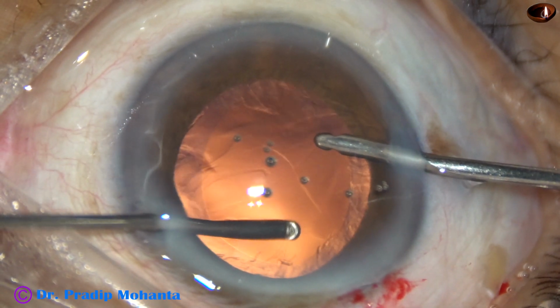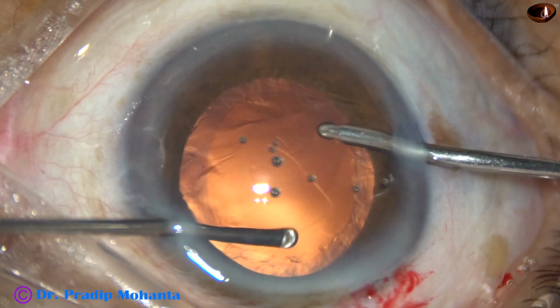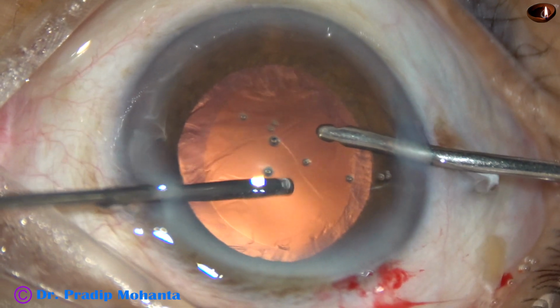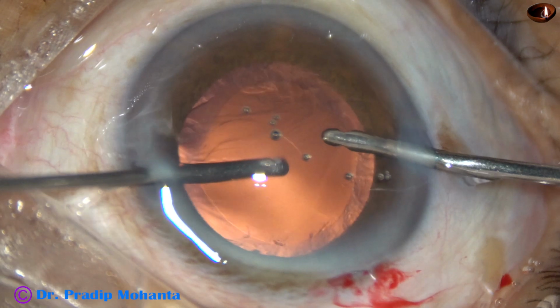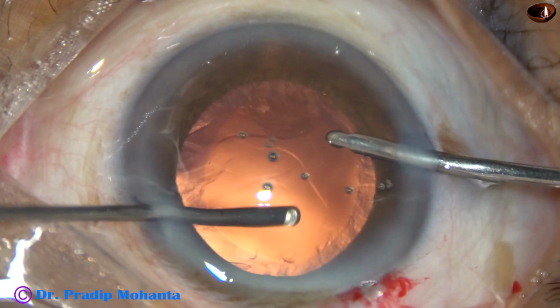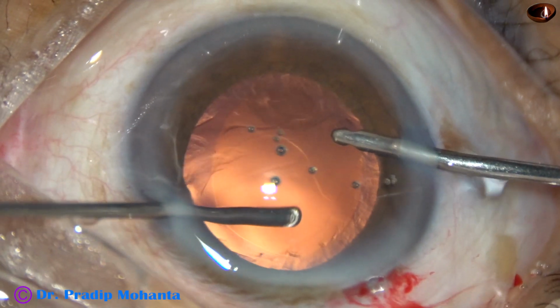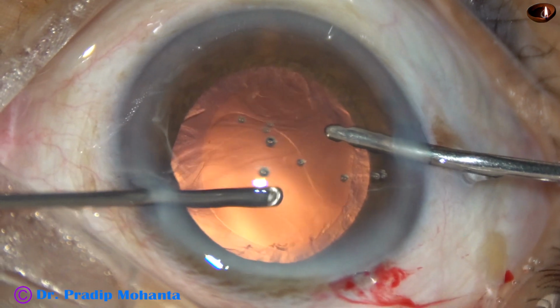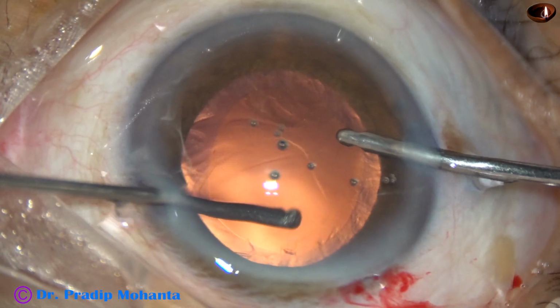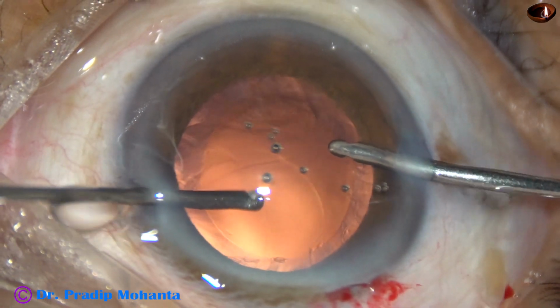The cutter has been placed in the anterior vitreous, a few millimeters behind the posterior capsular plane, say about 3-4 millimeter behind the posterior capsule, so that I don't pull the vitreous from behind. Rather, the vitreous strands that have come in the anterior chamber will go backward. Let me repeat this.